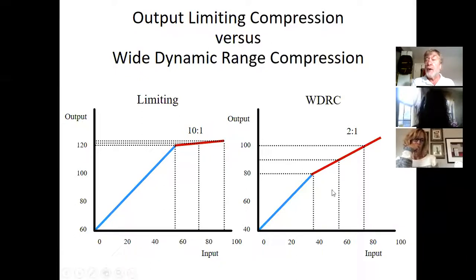If you look at the right, there's WDRC. You can see it's got a low knee point and a low ratio of compression. What do I mean by low? Less than 4:1. High knee point or high compression ratio is greater than 4:1. But look here too. Look at how 2:1 has a real gentle slope to it. It's barely any, it's from linear to 2:1.